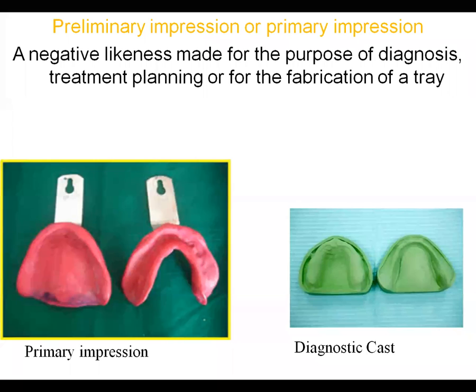To understand how our ridge form is, how the pattern of resorption is on that ridge, all these things, you should know vaguely how your foundation area is. For that purpose, we fabricate a diagnostic cast.